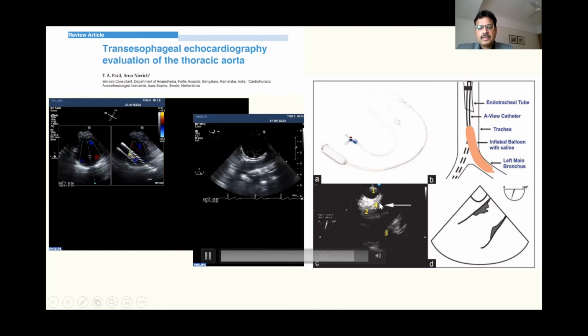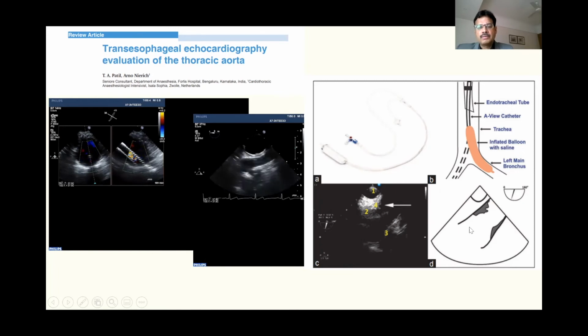This case study highlights a very dangerous high-level plaque which would increase the risk of thromboembolism, embolic events rather, for this patient.